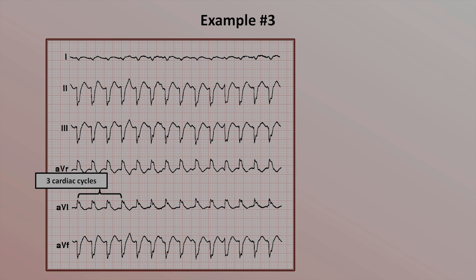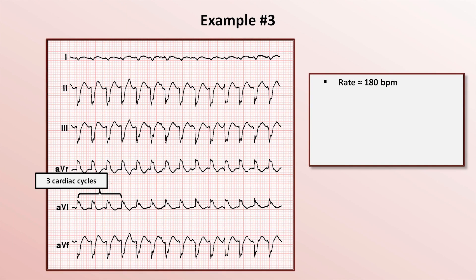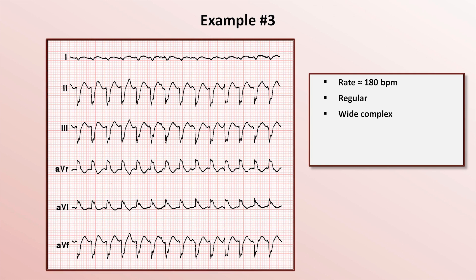In each 1-second interval, there are almost exactly 3 complete cardiac cycles. Three cardiac cycles in 1 second means 180 cardiac cycles in 1 minute — therefore the rate is about 180 beats per minute. It's regular, but the QRS width is slightly greater than 120 ms, making this a wide complex tachycardia.